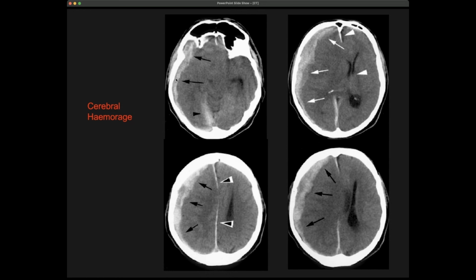But what we see here is a lighter part, and this is actually a bleeding. If there's a lot of blood, and especially after a while, it can become coagulated. Blood has a lot of iron inside, so blood will attenuate a little bit more, or at least static blood that has accumulated there. So you have a little bit more attenuation compared to the normal tissue, and this way you can see the bleeding.